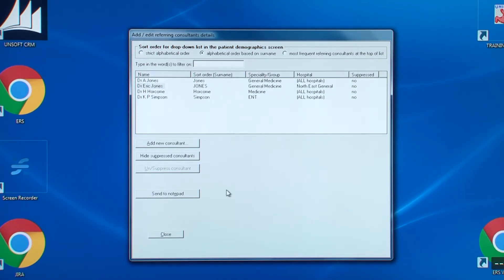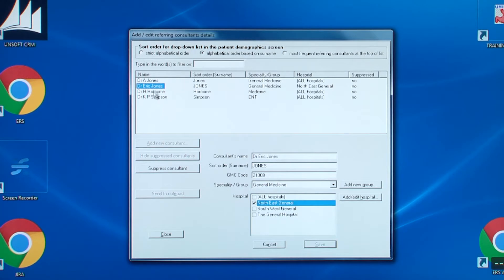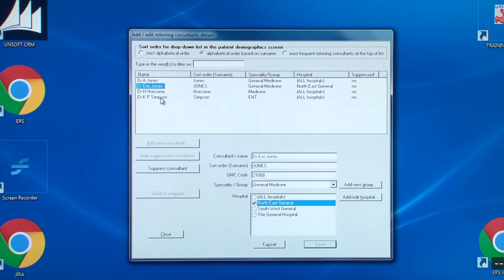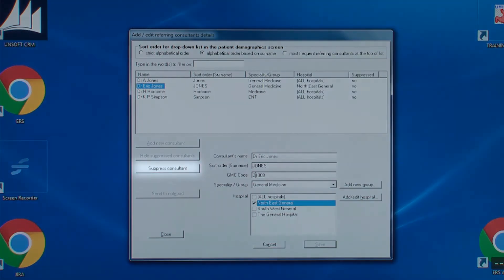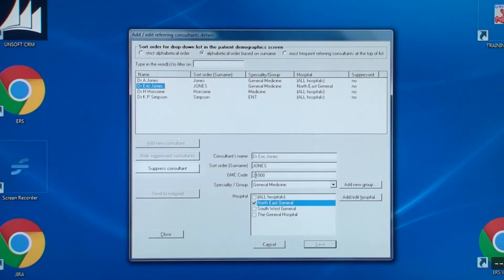You can edit any of the details by clicking on the consultant's name. Please note that you cannot change the name once it has been added. If you've made a mistake in the spelling of the name, then you must click the suppress consultant button. Now that we've finished, we'll close down this window and move on to the next item in the administrator utilities menu.